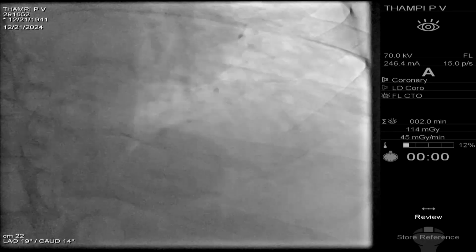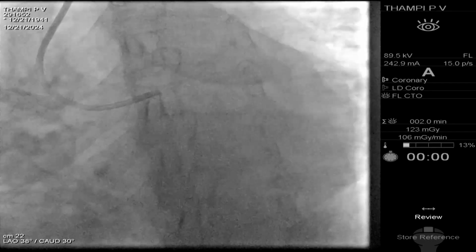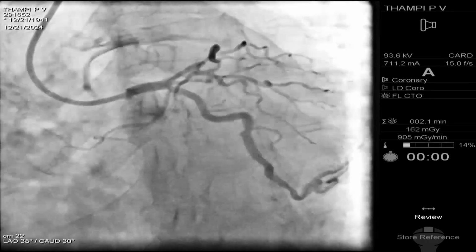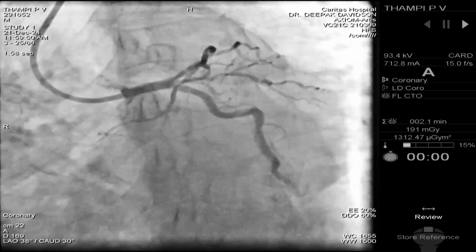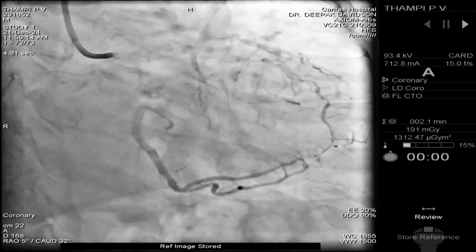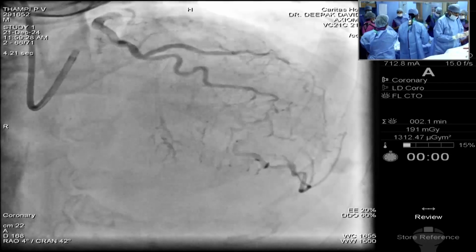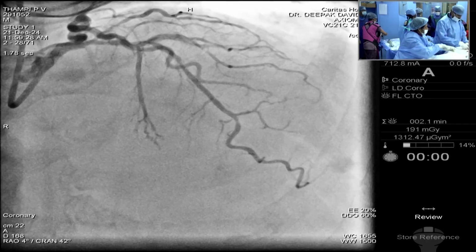Wire and OCT catheter. Okay, run through. It can be done either way. We have one parked over here always, and if somebody wants one nearby, they can also take it. The cost is not too much. It's only 15 lakhs or so. 1.5.